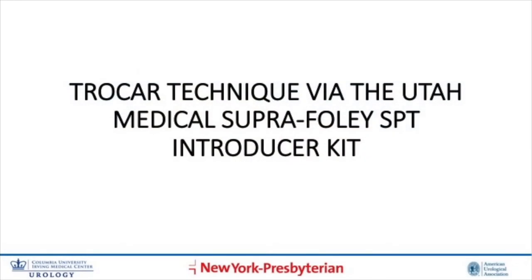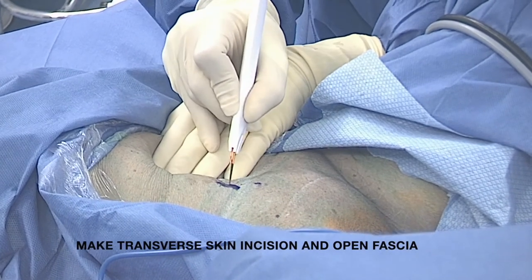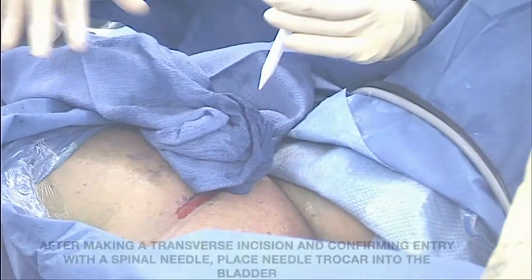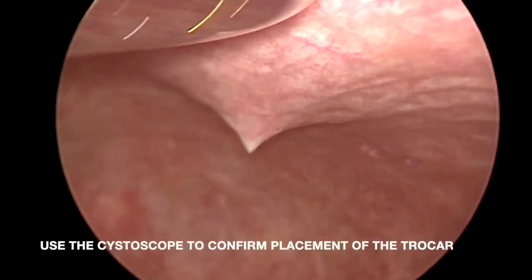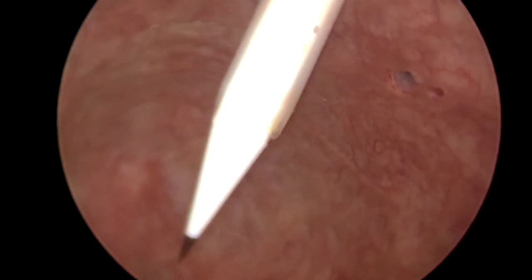Next, we will review the trocar technique for suprapubic tube placement. After performing the universal steps discussed previously, including the transverse incision, as well as confirming entry into the bladder with a spinal needle, we can then place a large needle trocar. Next, we can use the cystoscope to both adequately fill the bladder and confirm placement of the needle and trocar.